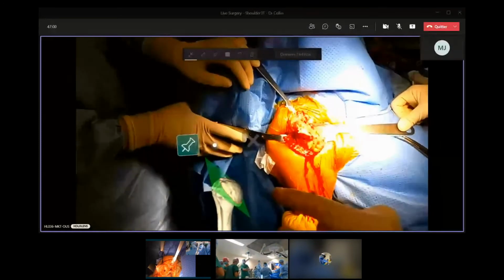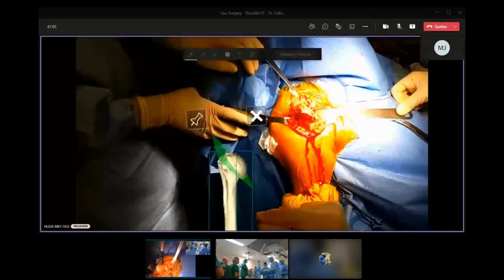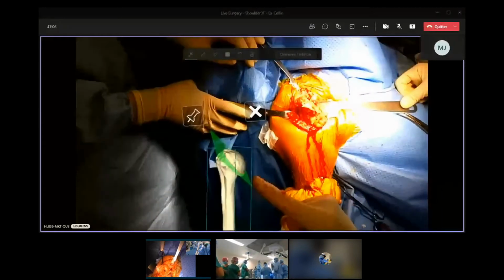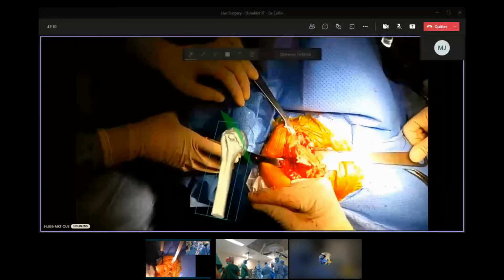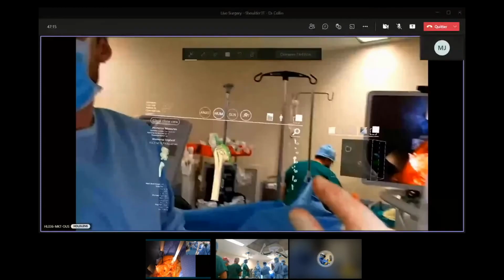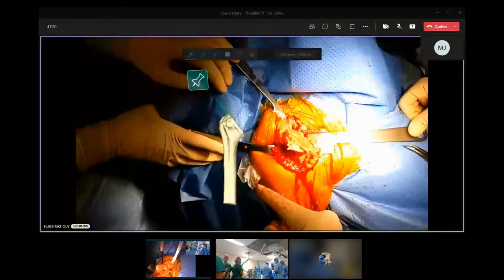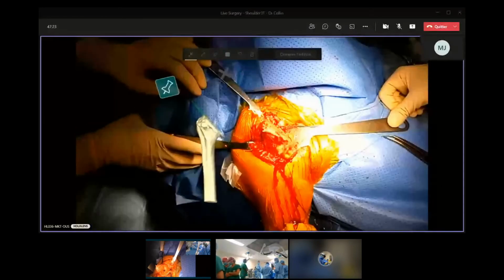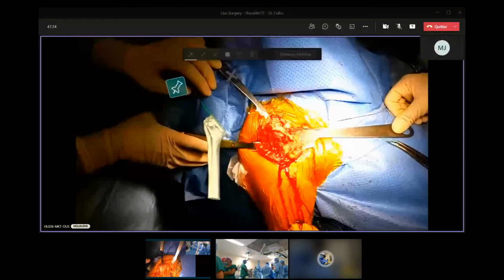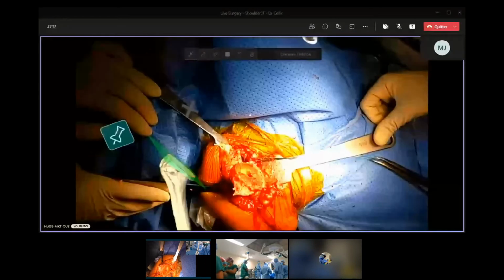So you remember that my humerus is here. If I want to modify it. 1B, 20 degrés droite. Oops. I can check this. What is interesting, you see, if I want to modify to have the cut now, I can have my cut here. You see? I can compare. And you see the small part of bone here, the small part of bone here. I'm perfect. Okay, we continue. 1B, 20 degrés droite. Ok, thank you Alex.